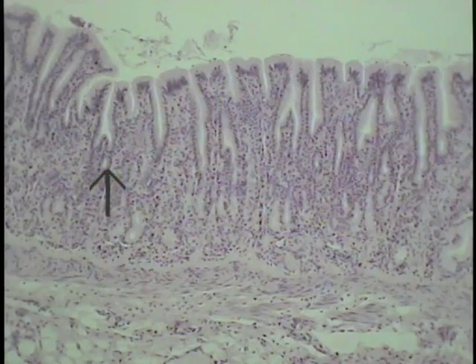And at the bottoms of these gastric pits, the cardiac glands, or the glands of the cardia, empty into the bottoms of these pits or terminate at this level. So this is the ductal system of a cardiac gland, one of these simple branched tubular glands usually. Here's its secretory units, and they are going up and then emptying into the bottoms of the gastric pit. Another gland is shown in this area and probably would be making its way here.